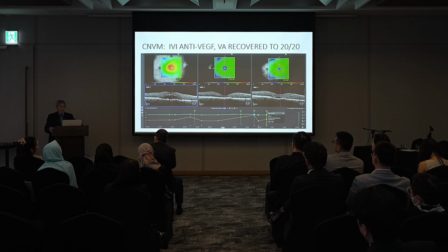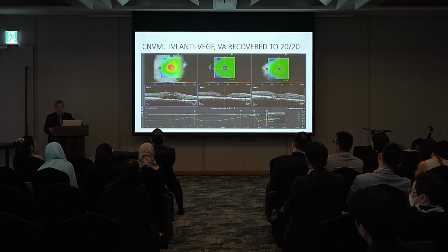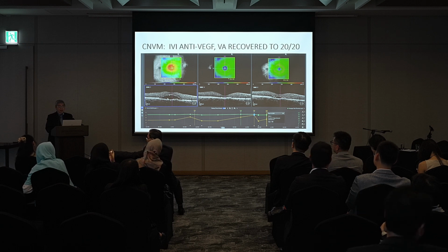Adrian? I think this is a very nice case because this is often a conundrum. About 16% of patients first diagnosed with acute CSC actually have an underlying choroidal neovascularization. And they will not settle, number one, with just observation. And number two, if you leave them, they can advance quite quickly, ending up with hemorrhage. So here you can see the response is quite typical of CNV, with anti-VEGF achieving dryness. If this was typical CSC, giving anti-VEGF is likely to have no effect at all, right? So I think this is really one of the main uses of OCT angiography now in my practice, to differentiate underlying CNV from true acute CSC, where you can observe for a little while.